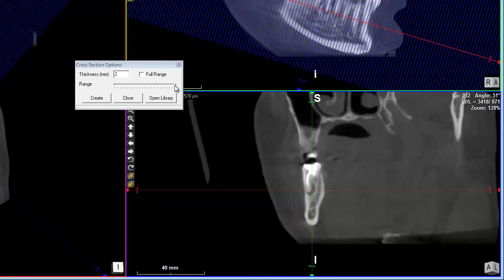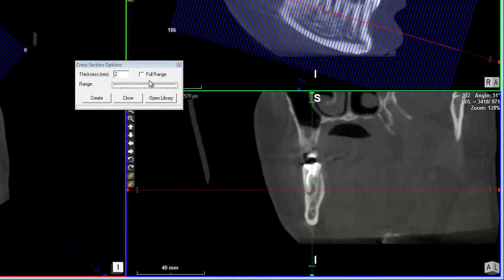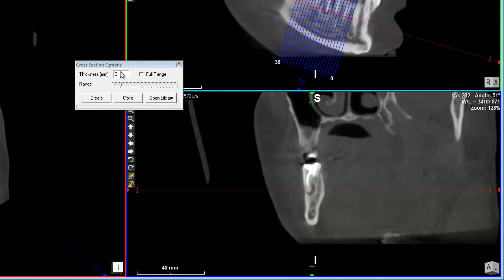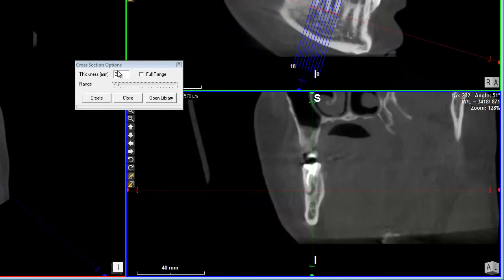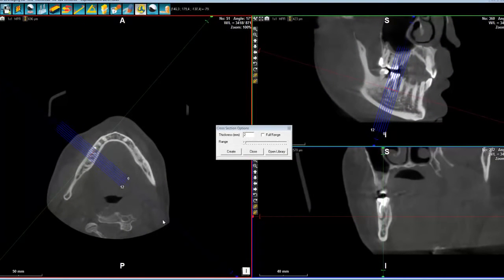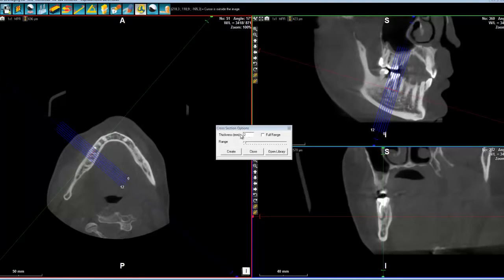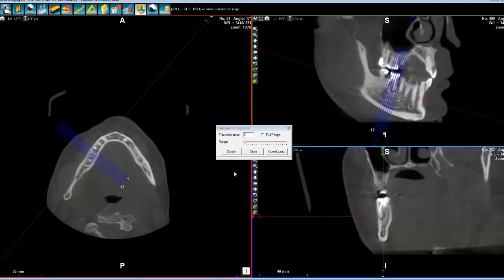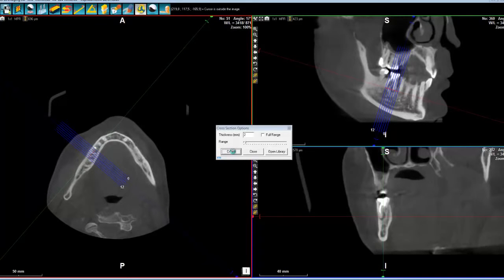And as you can see, if I reduce it, I'm able simply to diminish this number of cuts. There is a thickness here that is 2 mm. That means that there is a line, the space between these two lines is 2 mm. So I simply click on Create. And that means that automatically you will have all the blue cuts that will be sent to the report library.